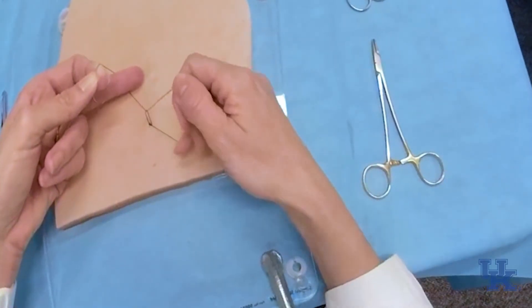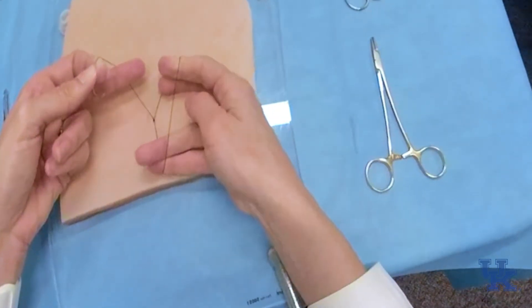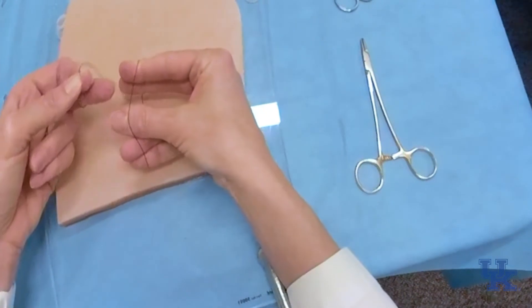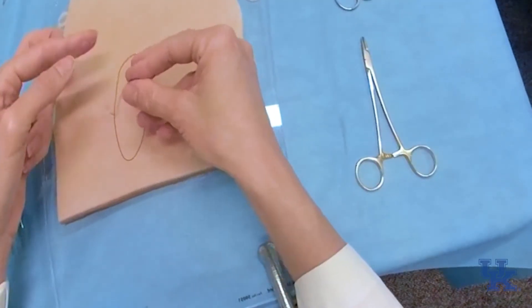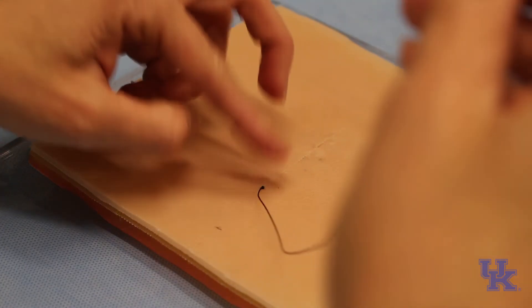I'm going to do this about three or four times, and then when I've done three or four knots, instead of holding this the whole time, I'm going to pull the whole needle through that loop, and that's the end of my knot.